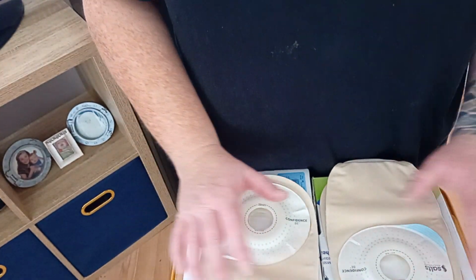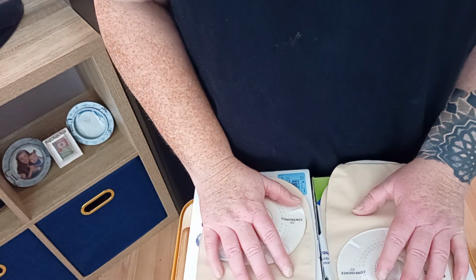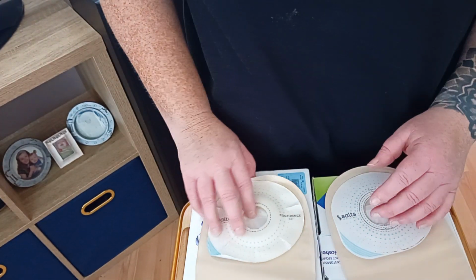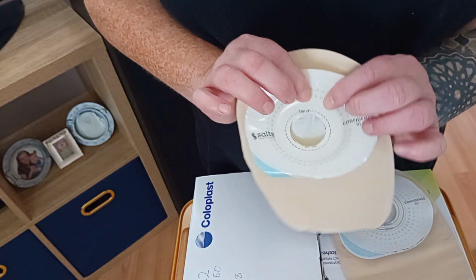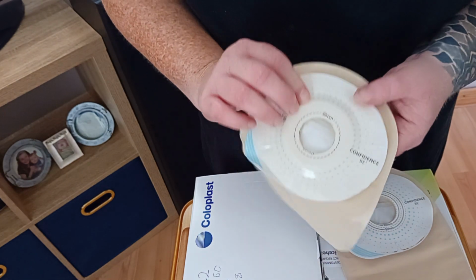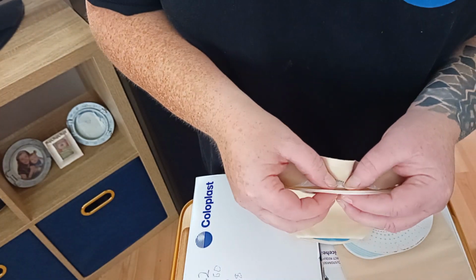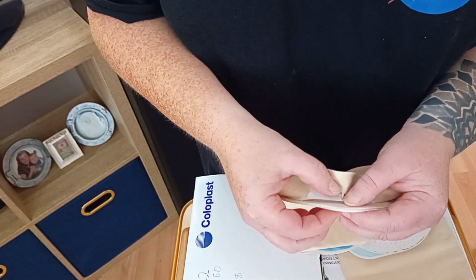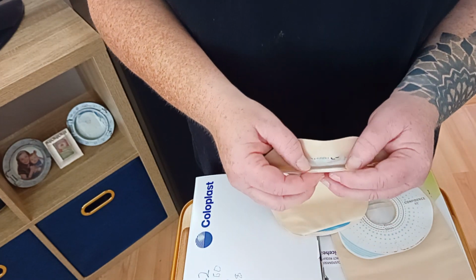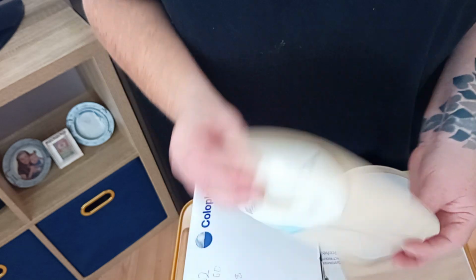So when you start with your stoma, you get different bags and stuff. Now, I did get this one, which has like a wee dish on it, and I loved it. It was really, really good. But this here is like prick pads, and it catches on your clothes because it's quite thick. So that's the first bag.